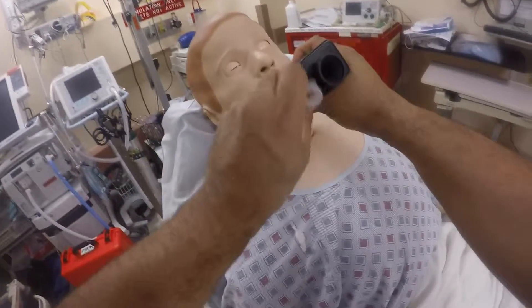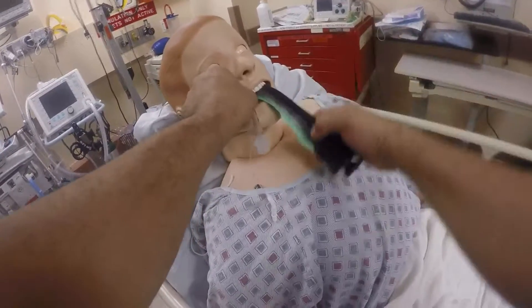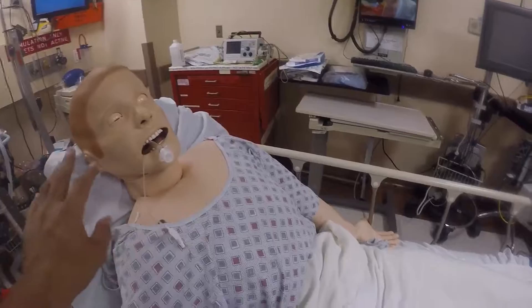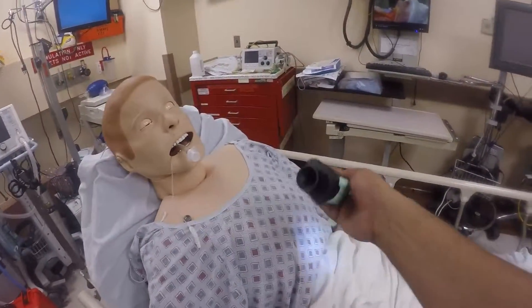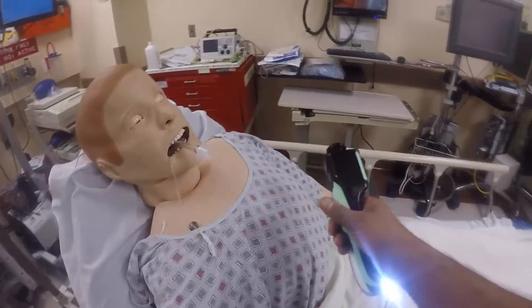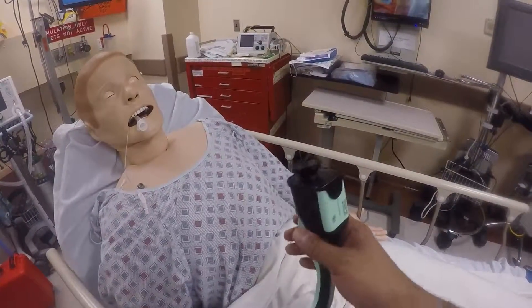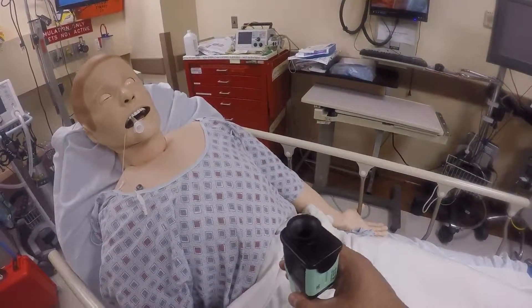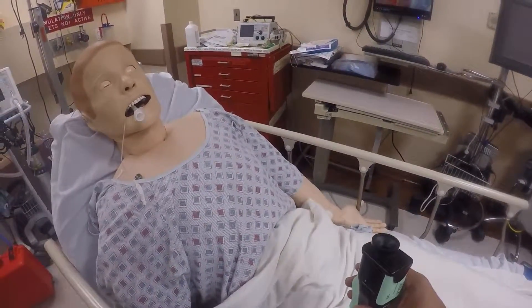This is not the newer version that has a channel head on top letting you view tube passage on a smartphone or computer screen. It's the original modified size small — like the MacGyver of the AirTrex. Once the tube is inserted correctly through the trachea, passing through the cords, you can always exchange it out with a bougie and swap for a bigger tube.